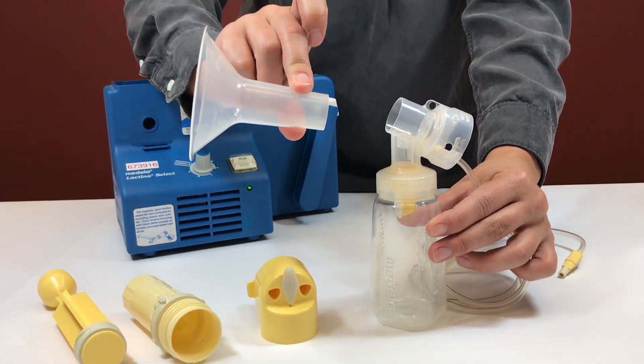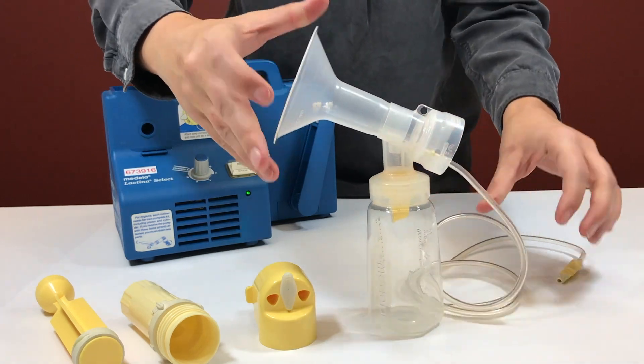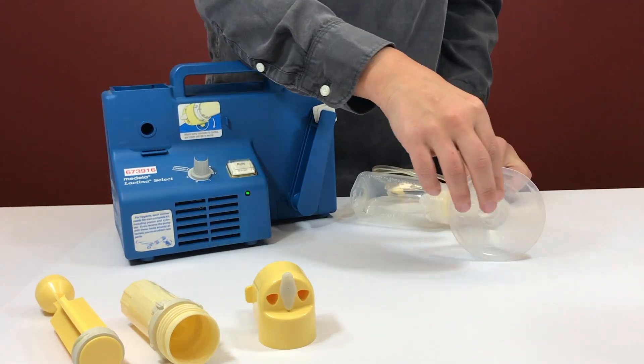Put the flange onto the connector. Use the side that feels comfortable to you. Repeat the process with the other bottle.